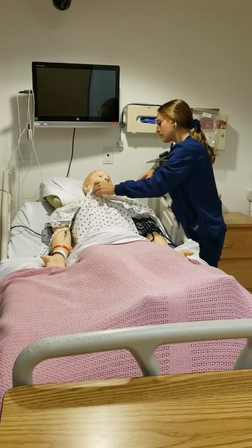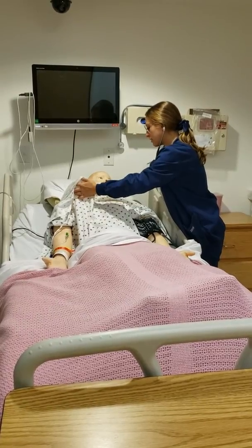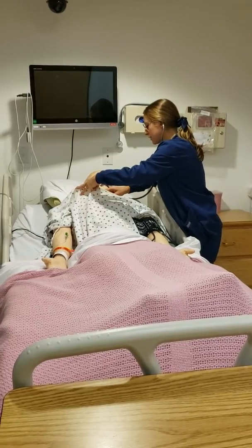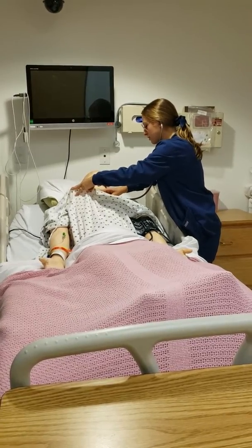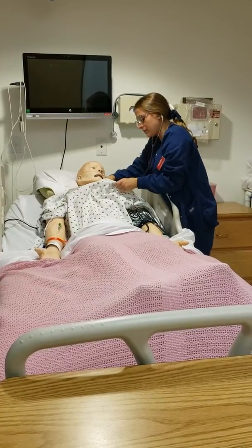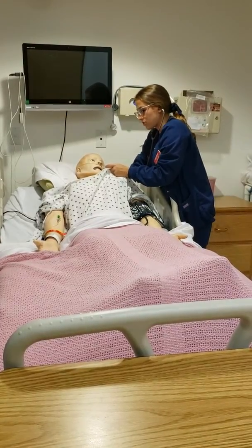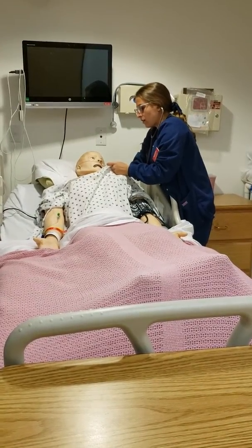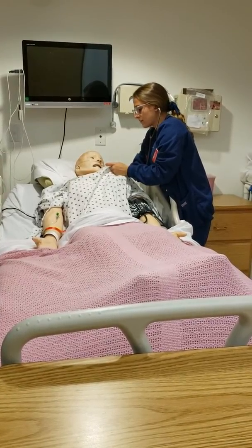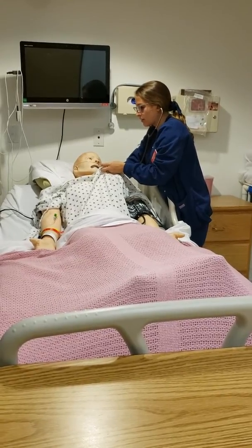Perfect. Now I'm going to listen to your heart sounds, starting at the second intercostal space on the right-hand side. Listening to your aortic, moving to the left of the second intercostal space to pulmonic, down to the fourth intercostal space at the tricuspid, and to the fifth intercostal space at midclavicular line for the mitral. At this point, I would also be listening to the apical pulse for 60 seconds. I would flip to the bell side to listen for any murmurs or bruits.